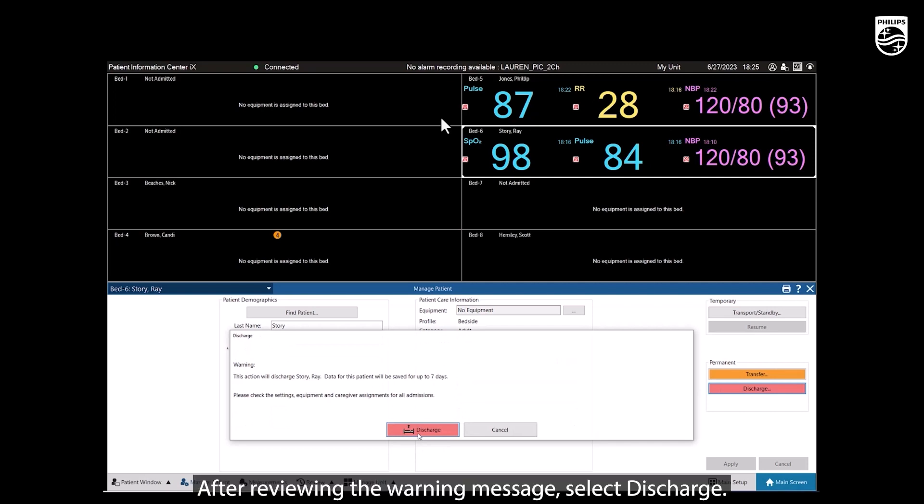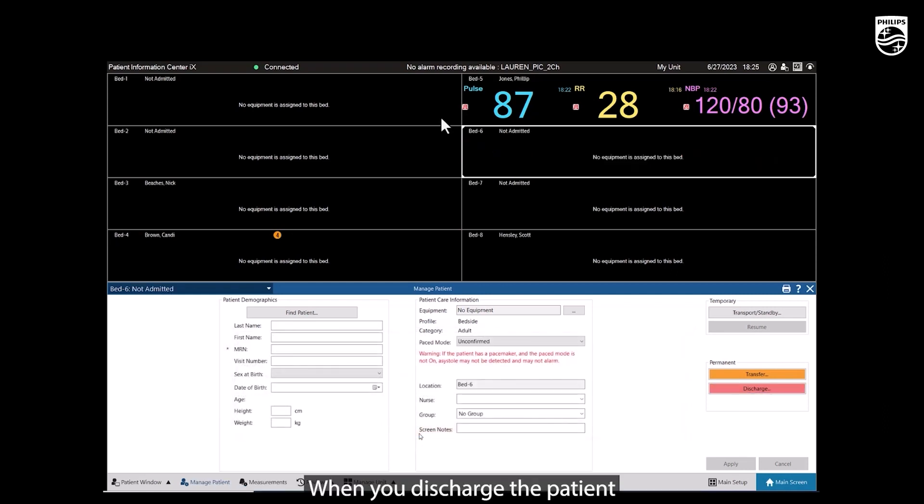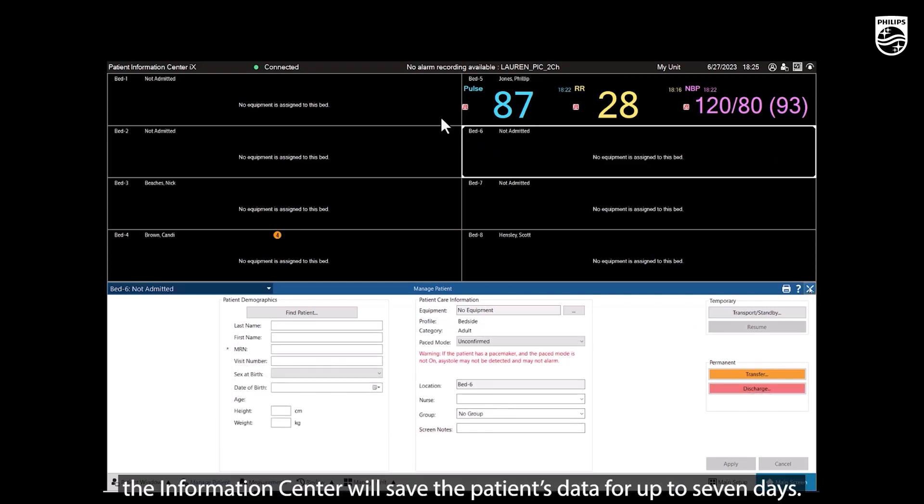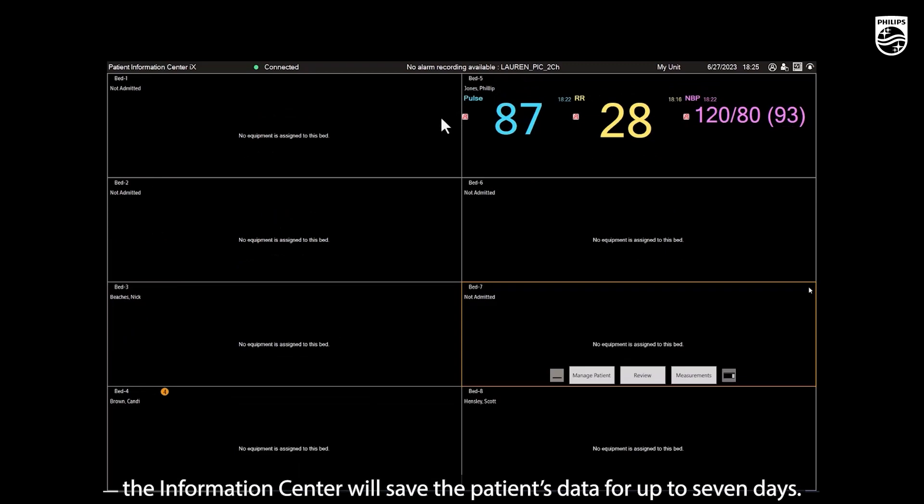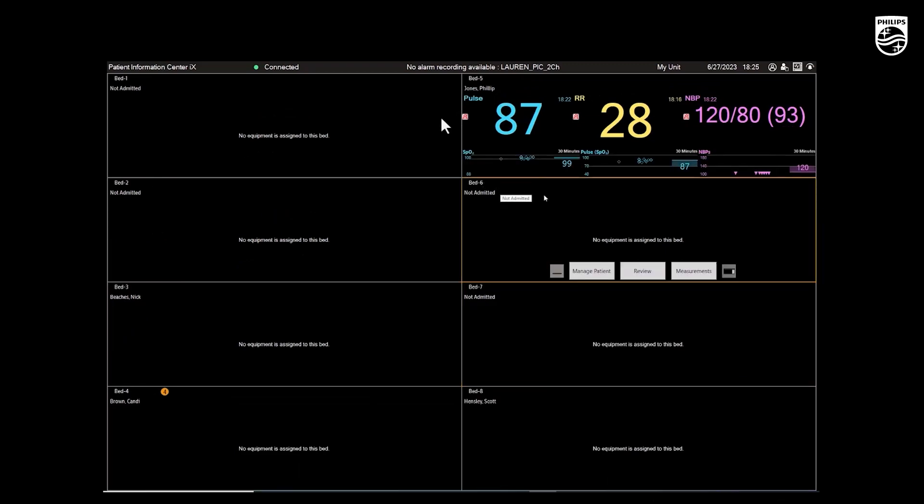After reviewing the warning message, select Discharge. When you discharge the patient, the Information Center will save the patient's data for up to seven days.